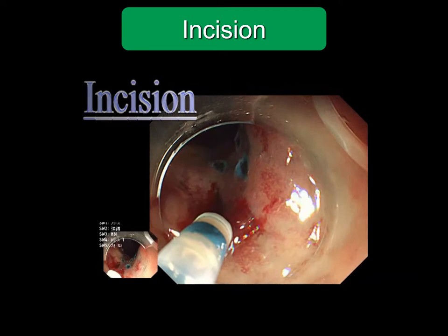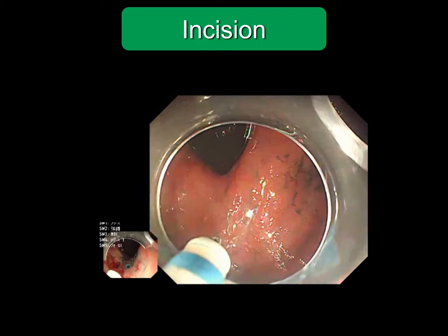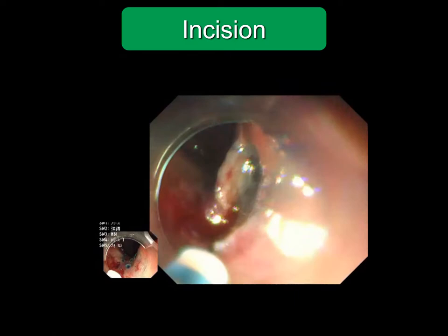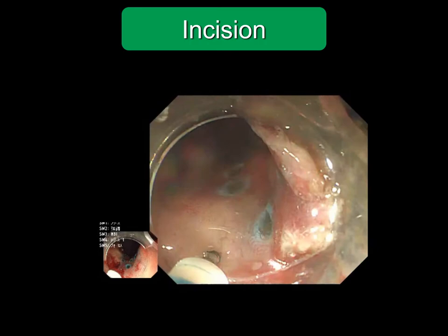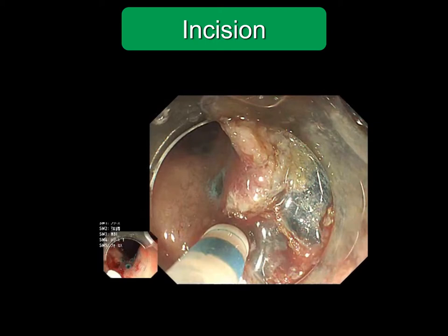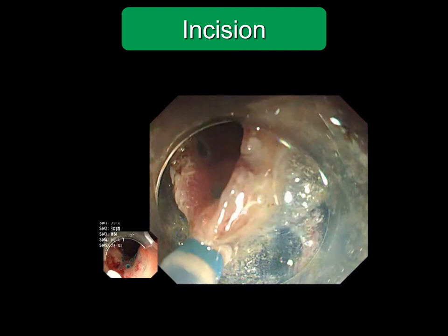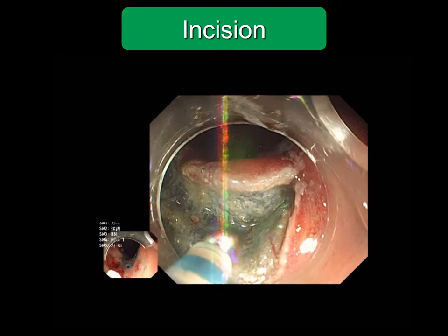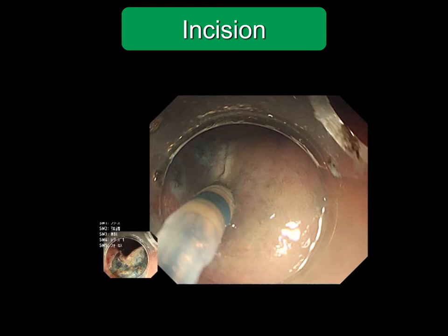A U-shaped incision is made to prepare a flap like this. It is safer to incise toward the lumen side. After incision of the mucosa, the incision line is traced several times to ensure cutting the muscularis mucosa. If the entire circumference is incised from the beginning, the locally injected solution flows out and does not effectively lift the lesion. There is a risk when an incision is made toward an invisible direction, so beginners had better incise toward the lumen side.